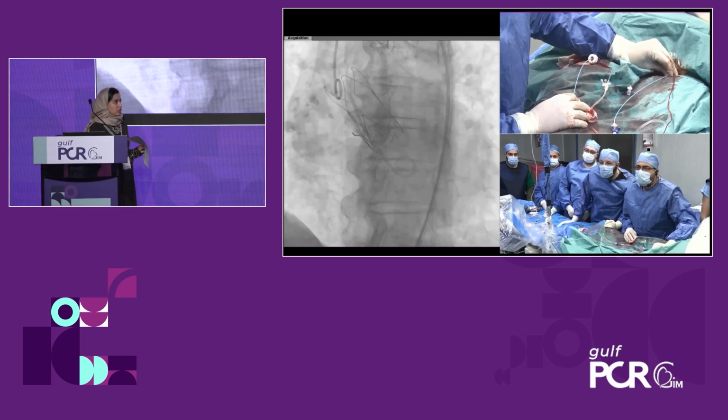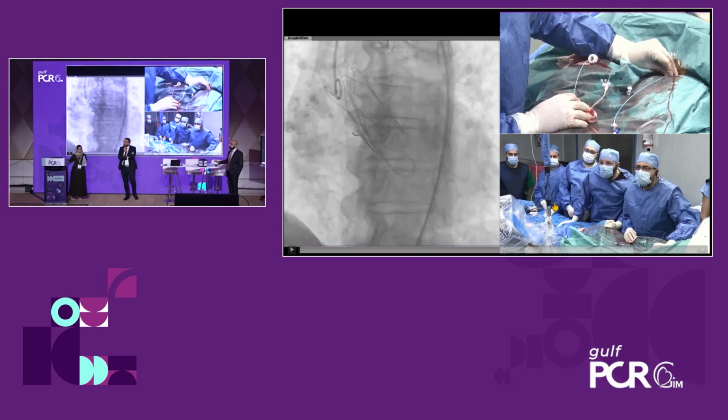But you did a really wonderful job, as Dr. Hijji was mentioning, two orthogonal views, and you've showed nicely that the valve is well expanded. Were you done with your case? So we're done, yes. All right, so excellent.